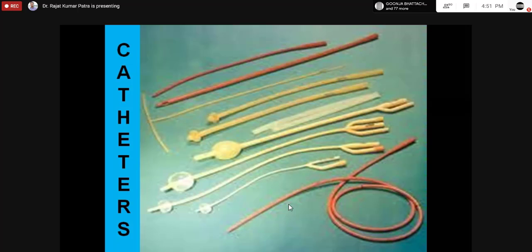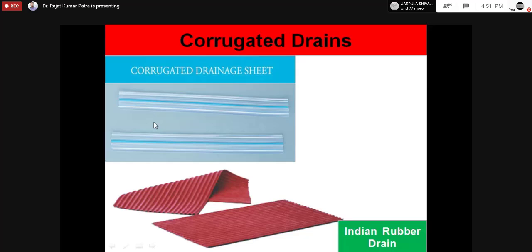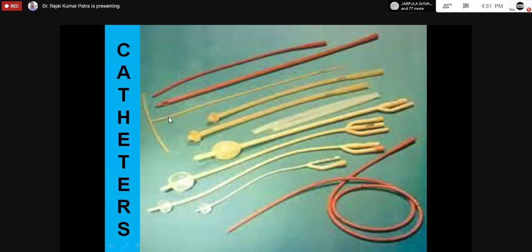So now tell me, there are different catheters, okay. This is a red rubber catheter. This one is a Malecot, but nowadays not used. This here is a T tube, mostly used in CBD exploration, common bile duct surgery, okay. T tube, but it's not kept, don't worry. Then these are all catheters. This is a Foley's catheter, 2-way, smaller size. Once you see it, the number is in French, okay: 14 French, 20 French, 10 French, 12 French, or 22 French.